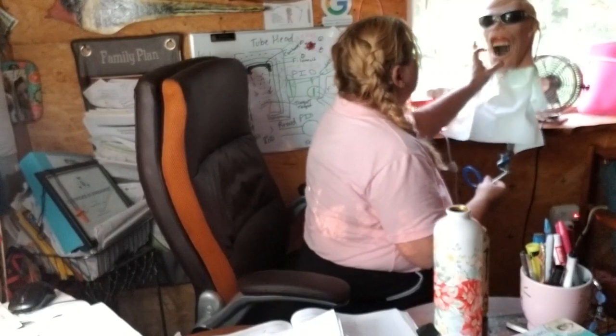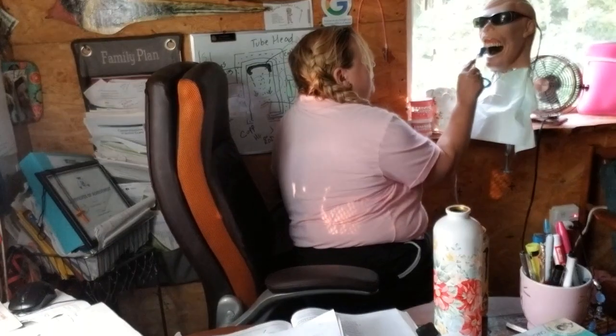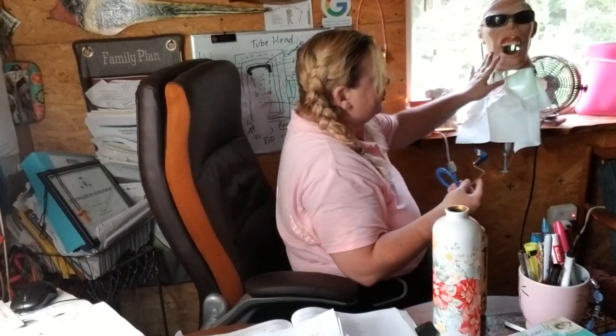When tori is present, the film must be placed on the far side of the torus, okay? So, let's just use Bob for a second. What I'm going to do is look inside his mouth first to see if he has bony tori on the bottom or on top. Of course, my hands will be gloved, in case there's any critics watching, there's always a critic. Then I'm going to put it in their mouth, but make sure it goes past that bony tori. Doesn't matter if it's upper or lower. They're going to get that bony tori, and it's going to hurt. That happens over time. It's bony growth that just grows from bruxism, clenching, grinding, you name it.